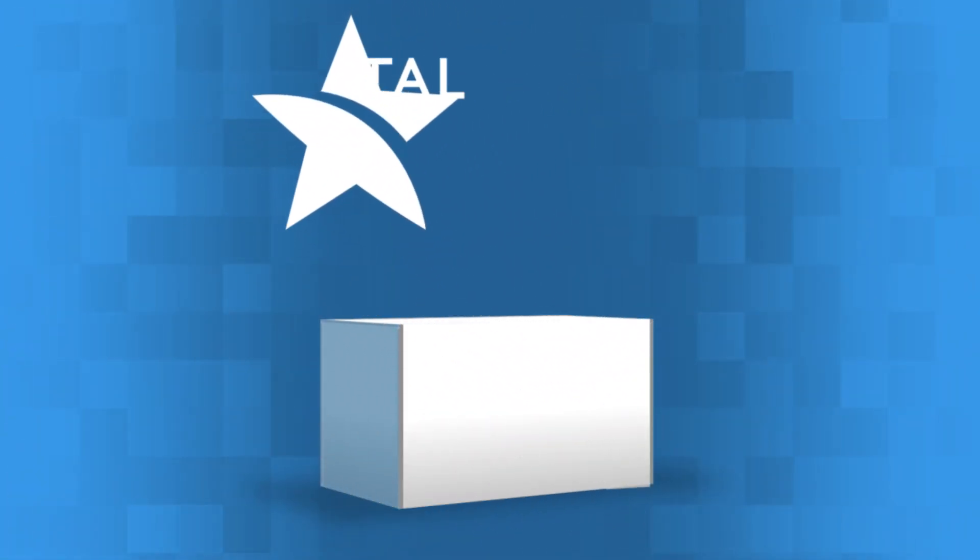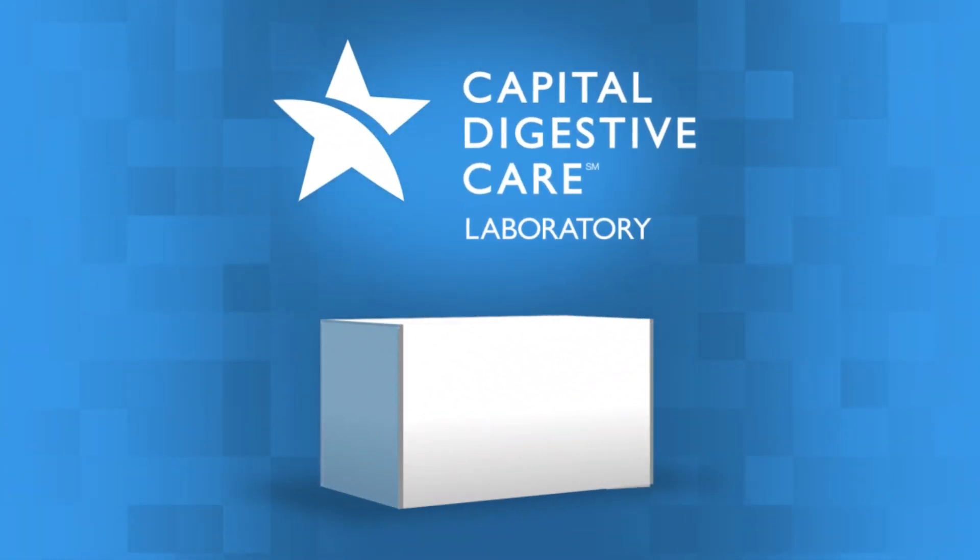Welcome to the Capital Digestive Care instructional video. This video will help guide you through your SIBO breath collection test.